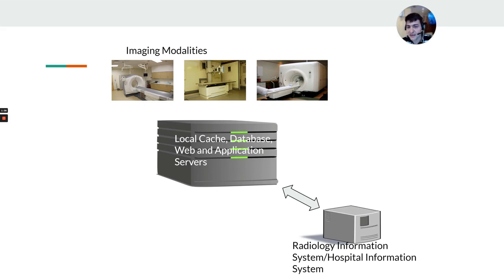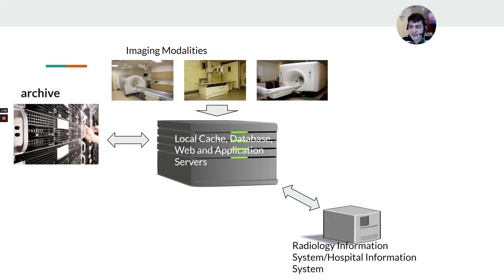They're going to come in what's known as DICOM format. Again, we'll talk later in future videos about what that is and why that's important. They're going to send images over to us, to PACS, for viewing, for storage, for diagnosing, for that type of business. So once that's done, again, we're obviously going to archive it.